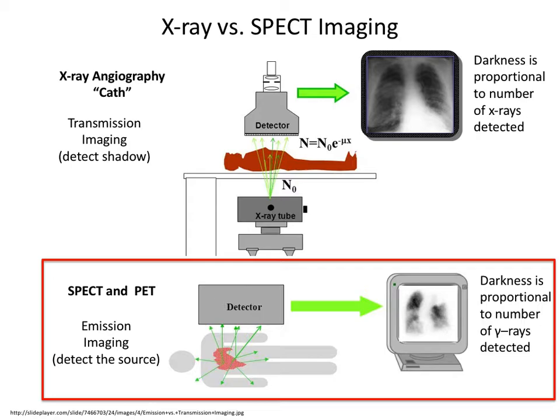And so effectively, if you have the right glasses on, they are glowing when you inject this substance into them, right? It turns out they would have to be gamma ray spectacles, right? They would have to detect gamma rays, and that person would be, if they're the one that got injected, the only one in the room that's glowing with gamma rays.